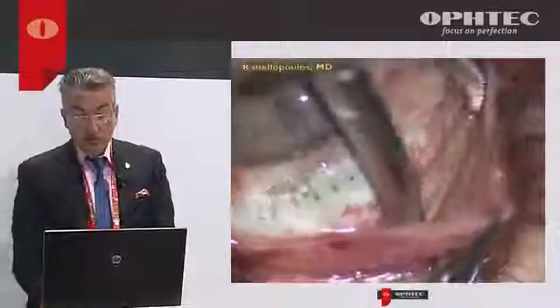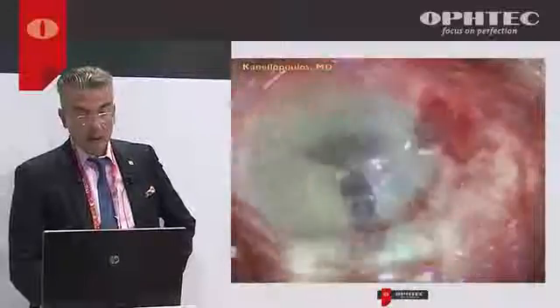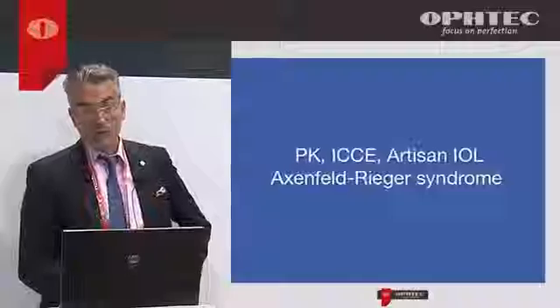This patient actually ended up doing extremely well. The bullous keratopathy resolved, and the intraocular pressure was under good control. So it's a very easy procedure in comparison to suturing the lens on the iris or the sclera in this eye that had multiple surgeries.